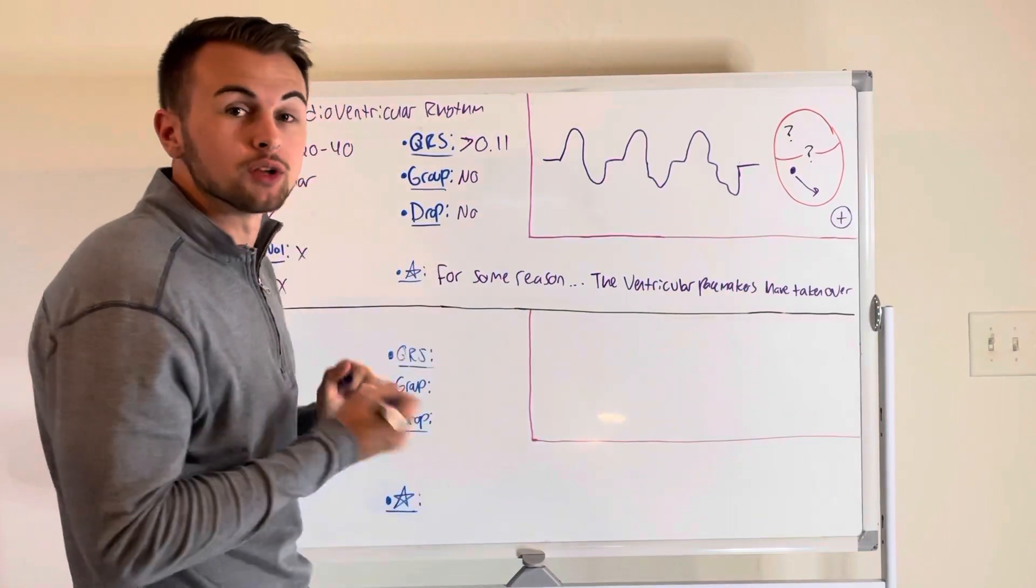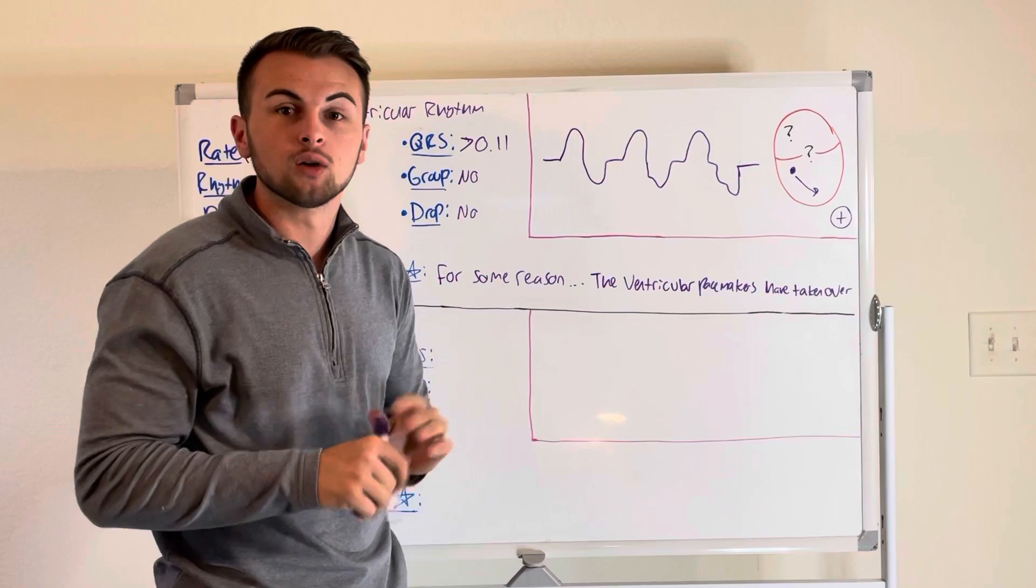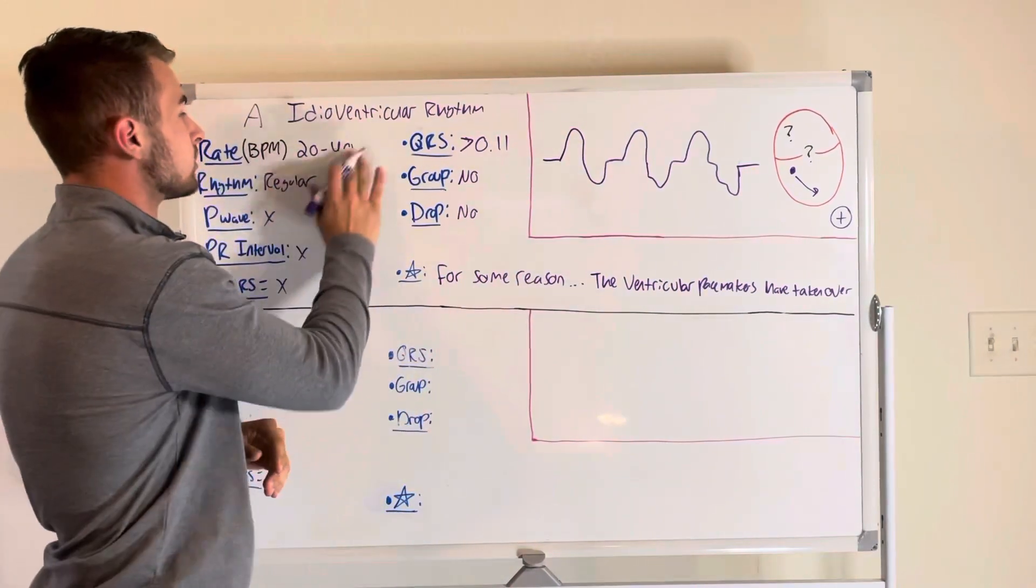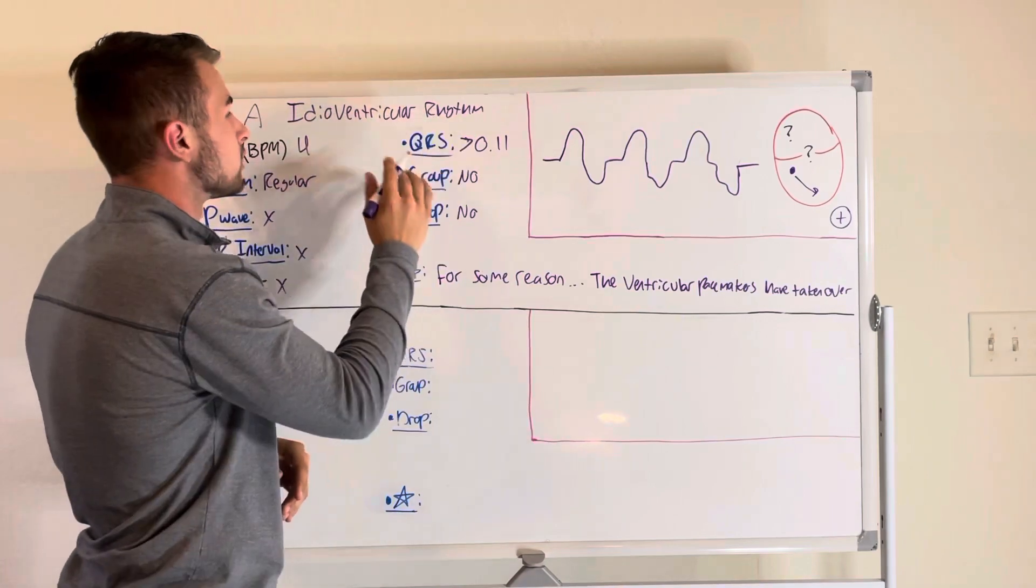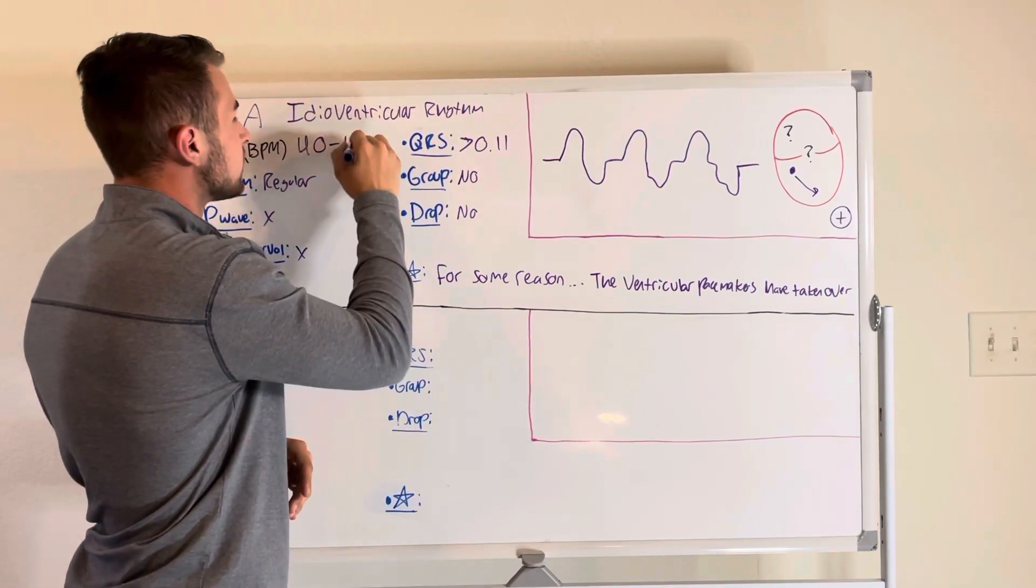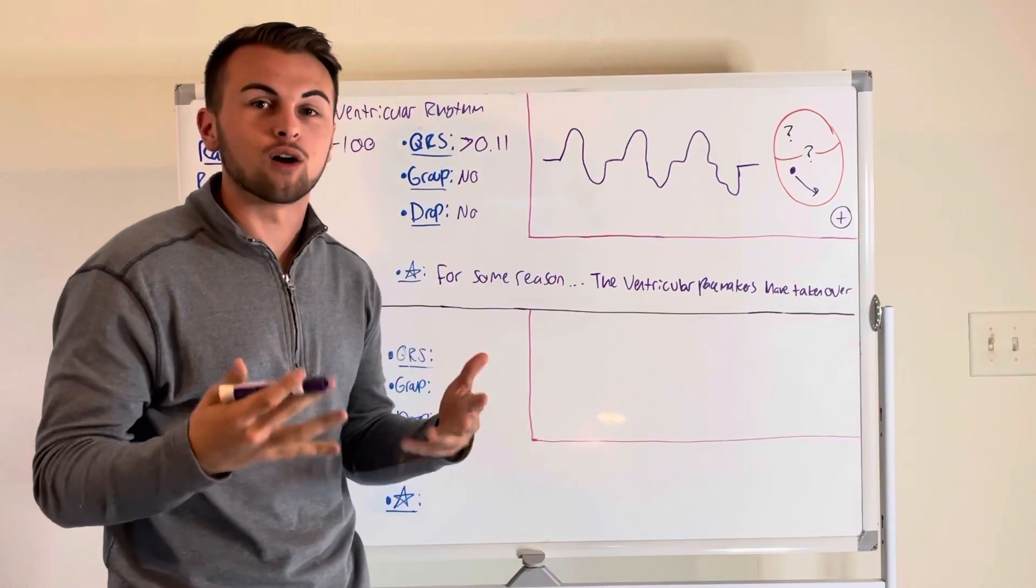Now I will show you the accelerated idioventricular rhythm. The only thing that has changed between an idioventricular rhythm and an accelerated idioventricular rhythm is that the rate is now 40 to 100.